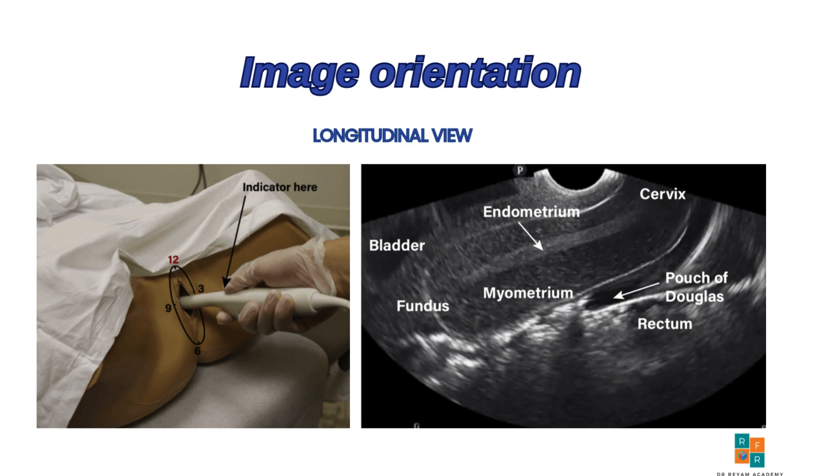The cervix is typically positioned toward the right side of the screen. In the case where the uterus is anteverted, the fundus will appear on the left side of the screen. But if it is retroverted, the fundus will be seen on the right side.